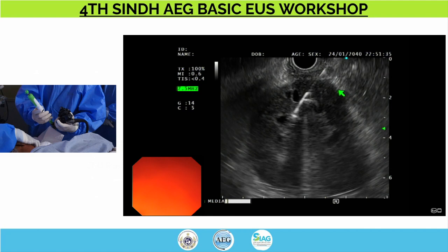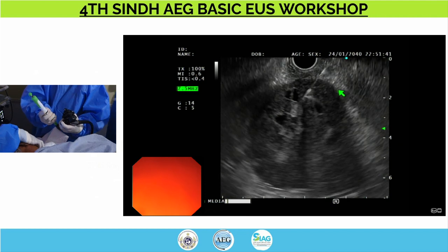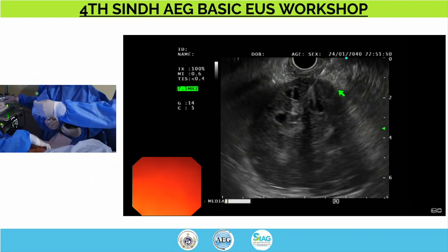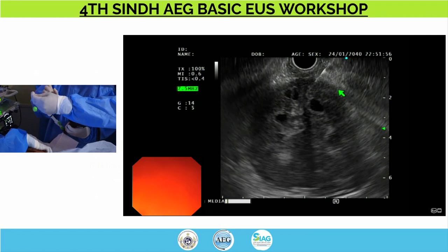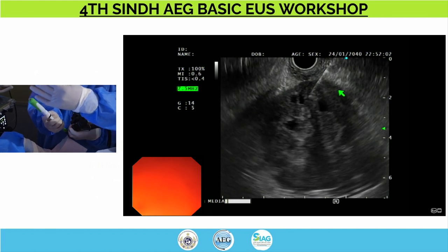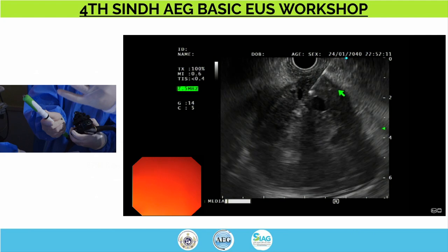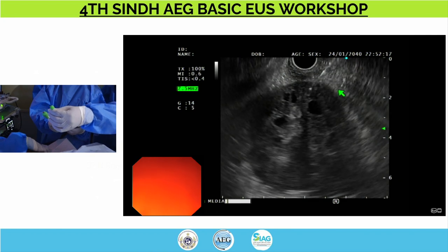You can see the echogenic tip, it's entered into the tissue, and now we have somebody slowly pull back on the trocar as I enter in and come out. So I'm entering in and coming out. This is a more rapid insertion, a slightly slower withdrawal, and as we are doing that, we are playing with our larger knobs to move the lesion relative to the needle and sample a different area. So I'm moving down, then I move the lesion a little to the right, I sample that area, then I can torque my scope a little bit if needed and sample this area here.